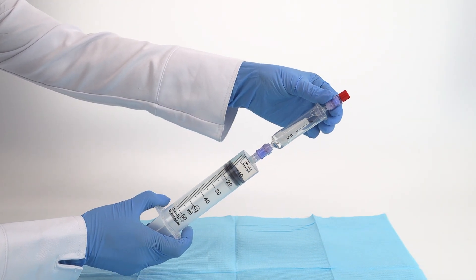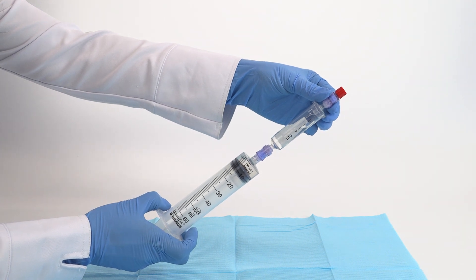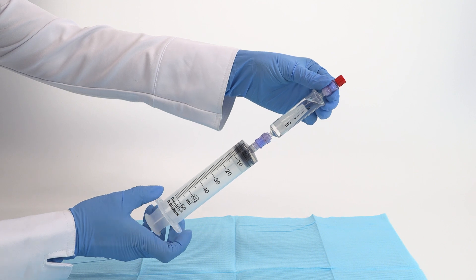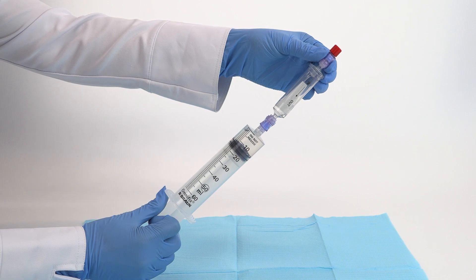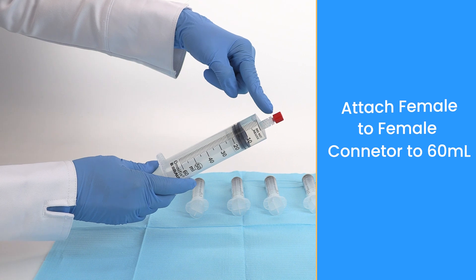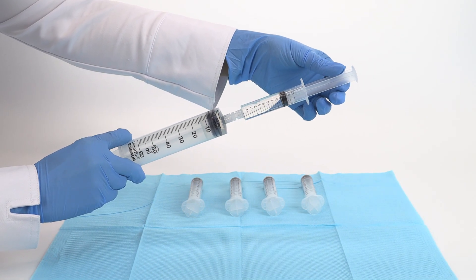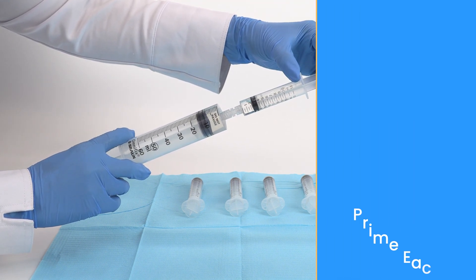Connect the heparin syringe to the outport of the BMA filter and prime the filter by injecting and removing the anticoagulant. Transfer the heparin to five 12 milliliter syringes, putting one milliliter of heparin in each syringe.